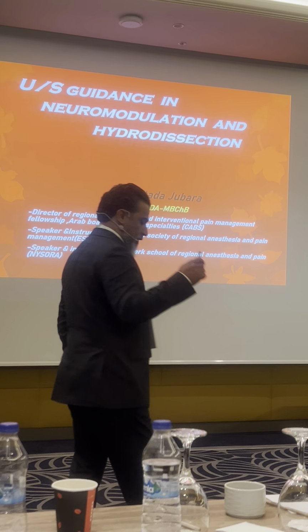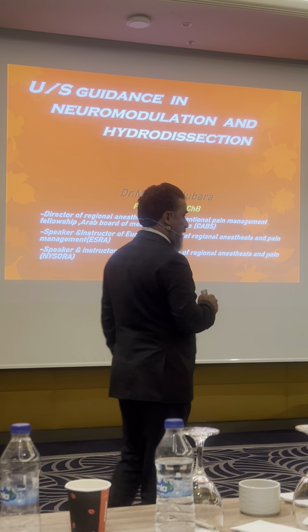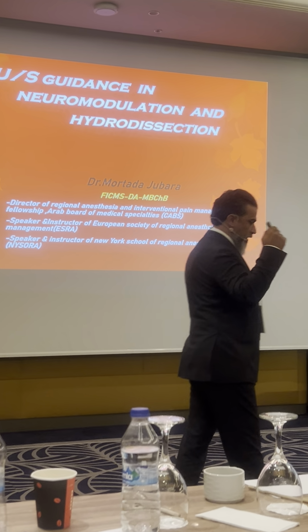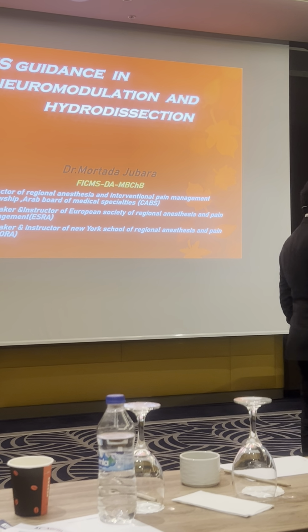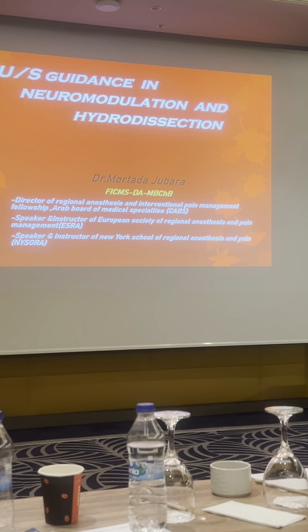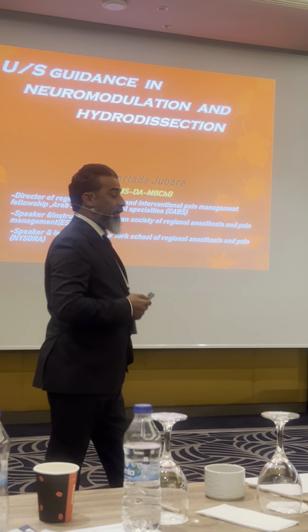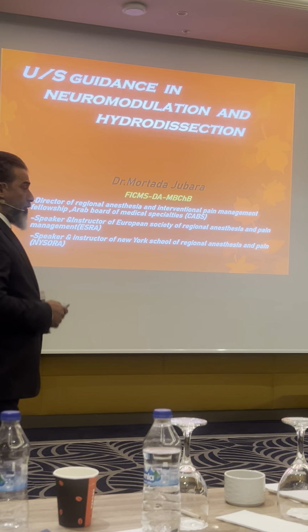So here, the topic is ultrasound guidance in neuromodulation and hydrodissection. Here we use our skills in ultrasound guidance and also the skills of neurophysiology by the generator to get functional recovery and pain control together, not just pain control.